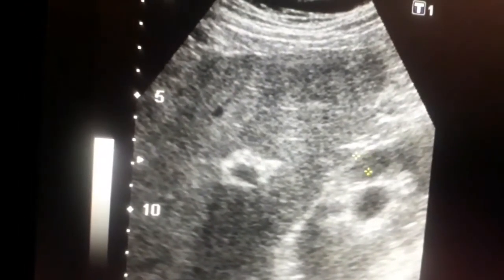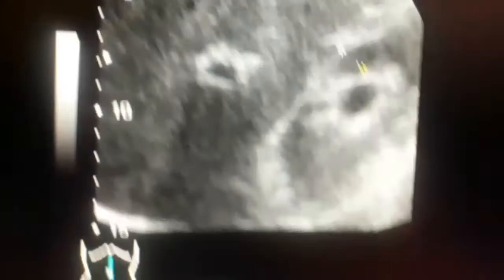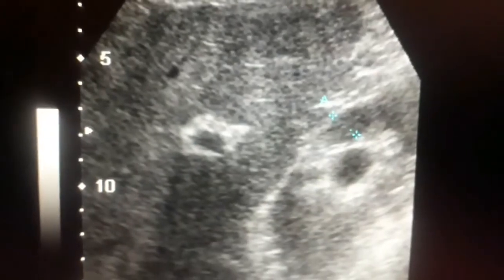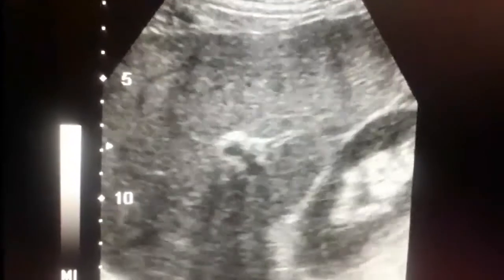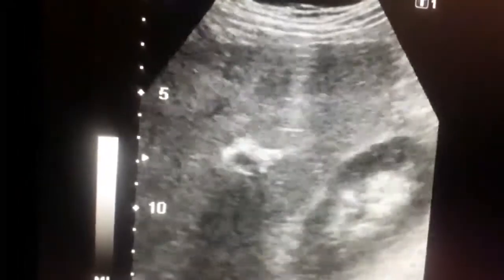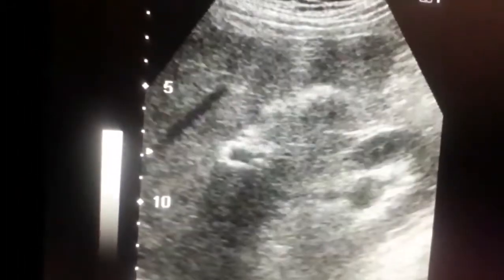I am measuring the cortex. The thickness of the cortex should be about 10 to 11 millimeters. If it is less than 10 to 11, that can be present in different conditions like chronic renal failure or a hydronephrotic kidney. You can see the kidney is having a distended pelvis, which could be due to obstruction.